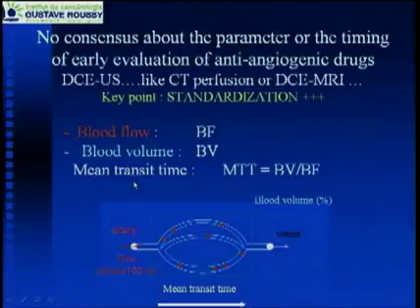But remember, the difference between DCE-US and CT perfusion and DCE-MRI is the size of the microbubbles. In fact, our microbubbles stay in the vessels, so we are not able to evaluate the permeability.